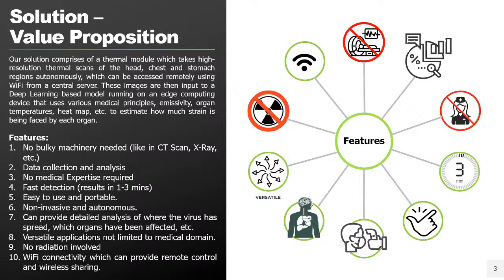The problem with other medical tests that detect COVID-19 is that they don't have much application beyond this detection application. In thermal imaging, this device can directly be used as it is in other domains like surveillance and fault checking.